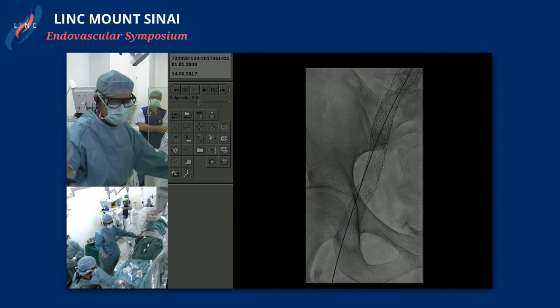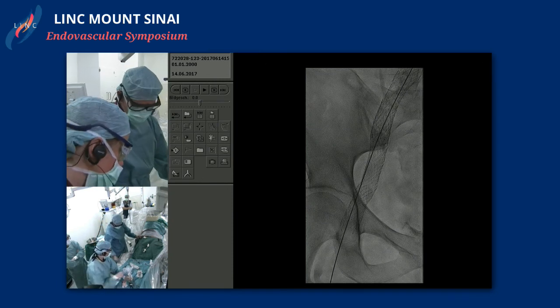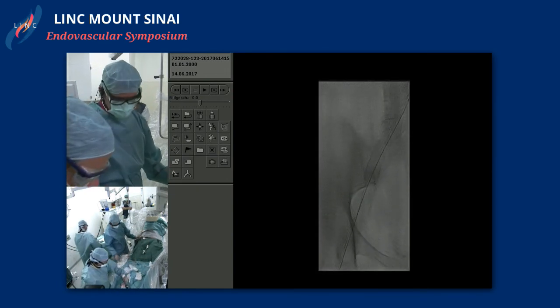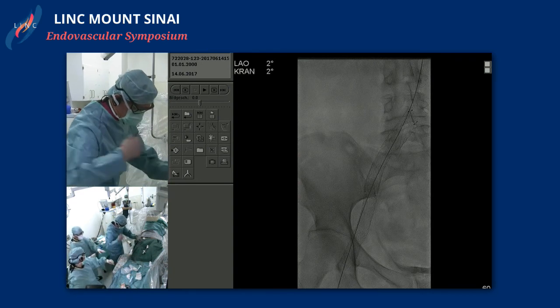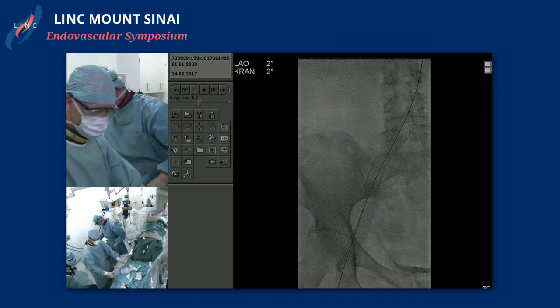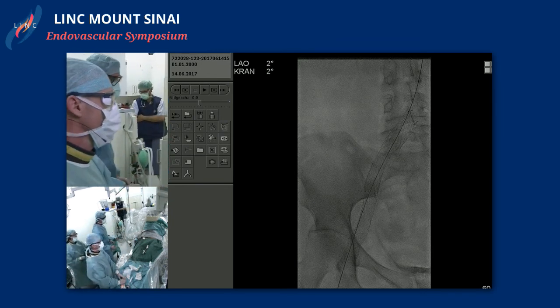We can give you now already a venogram, and then depending on your time, you can wait for post-dilation, or we can show the result later here. Michael? I think we have time to see the venogram, and I think we're going to move on then. Okay, noch einmal Apnoe bitte.